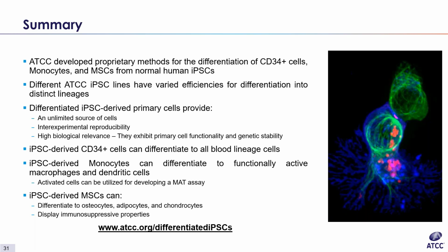So the iPSC-derived MSCs came from iPSCs that originally were developed from bone marrow CD34 positive cells. And all of the iPSCs were selected for commercialization based on their overall performance.